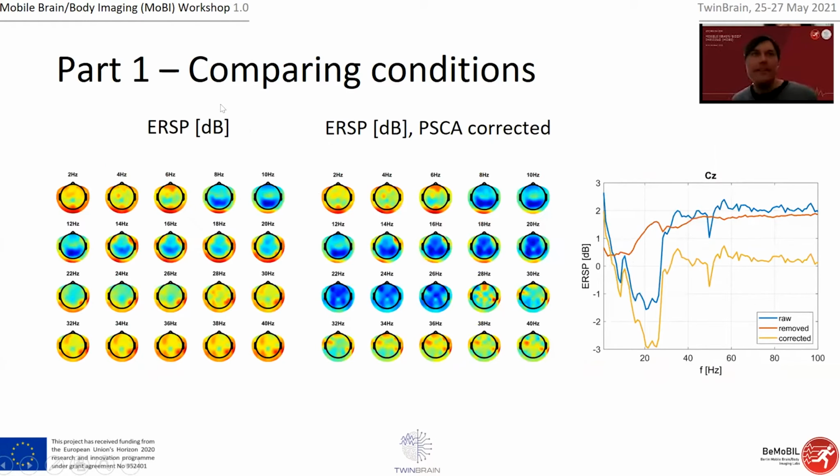Meaning we can look at the ERSPs in terms of frequency spectra. We found this very strong beta suppression located roughly over sensorimotor areas. This is just a bit speculative for now. But we were also successful in replicating the spectral shape of this artifactual component I was removing before. If you compare standing to walking, you can always find it, at least I found it in every participant I was studying.